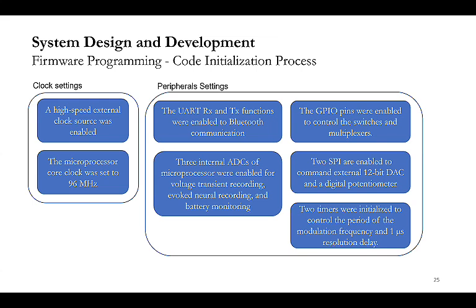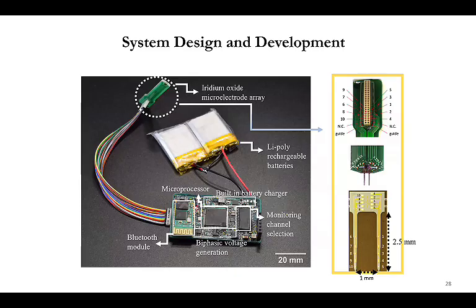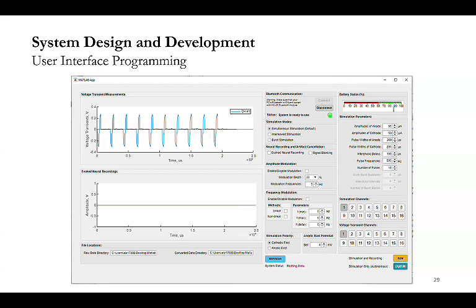Then after all the firmware programming, electrical tests, and assembly, you will see the whole picture: a rechargeable battery and microelectrode arrays already assembled to the Omnetics multicolor cable. And this is the interface that I also designed in MATLAB App Designer to set the Bluetooth communication control, like enable and disable easily, and set stimulation modes.